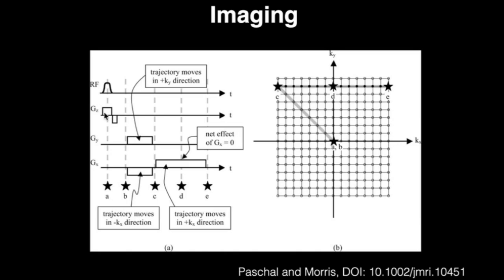But that is overlaid with a gradient on the z-axis here. So this is analogous to what I was showing a couple slides ago with the patient with that z gradient along their head to foot. And what this GZ is doing is selecting a particular portion of tissue that matches the resonant frequency of this pulse. So this part of the sequence is the slice selection or slab selection region of the pulse sequence.